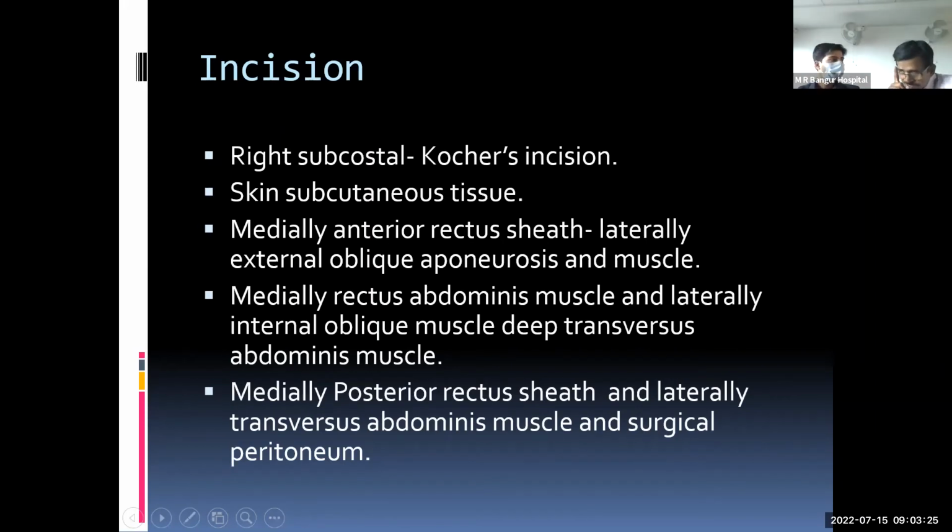While you are making the subcostal incision, when you cut through the structures, are the structures the same throughout the whole incision, layer by layer, or are they different?